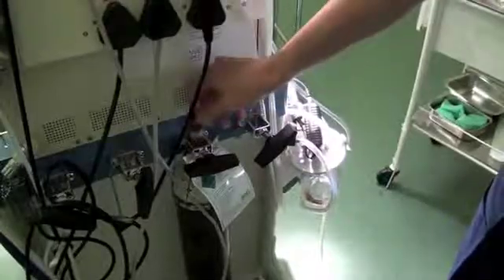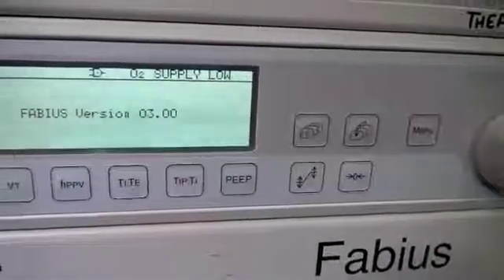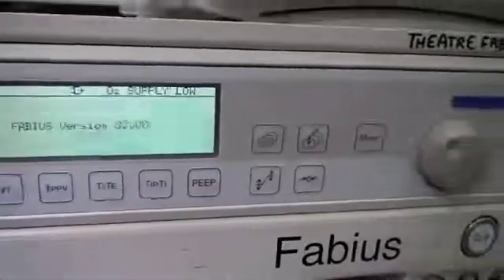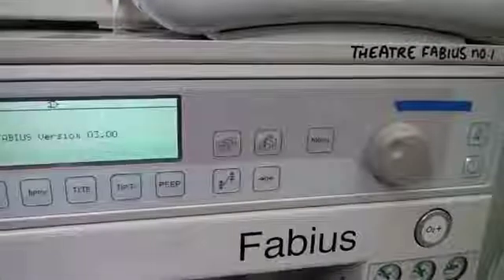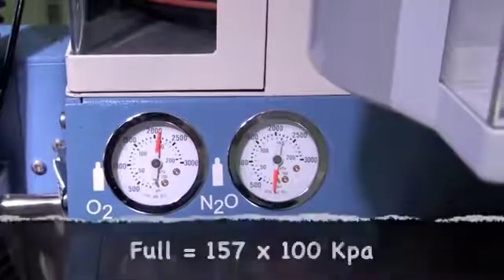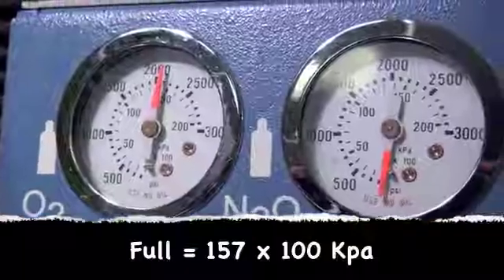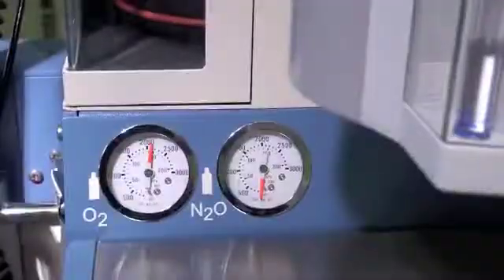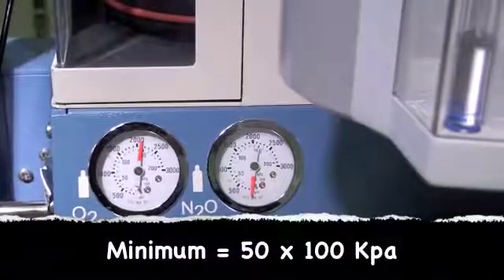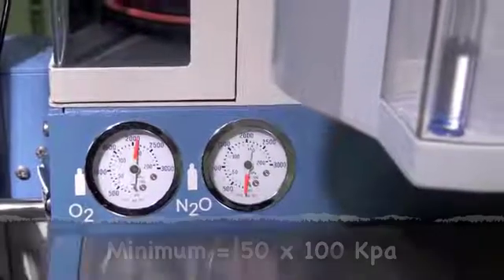You must open the valve fully. Having opened the emergency oxygen cylinder, the oxygen failure alarm should disappear. It is essential to check the emergency oxygen cylinder pressure. A full cylinder has a pressure of 15,700 kPa. The cylinder must have at least 5,000 kPa of pressure in it, otherwise it must be replaced.